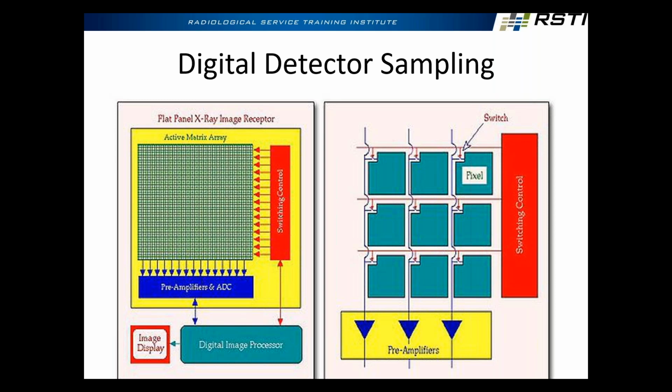How many shades of gray can the human eye distinguish? And it's more than 50. 256. Yeah, you're absolutely right. For a trained radiologist, they can distinguish about 256 shades of gray. So I have 12-bit processing that gives us 4,096 shades of gray. We window and level. We can control which 256 we're seeing or which 256 we bring into our viewable range. So kind of nifty, right?